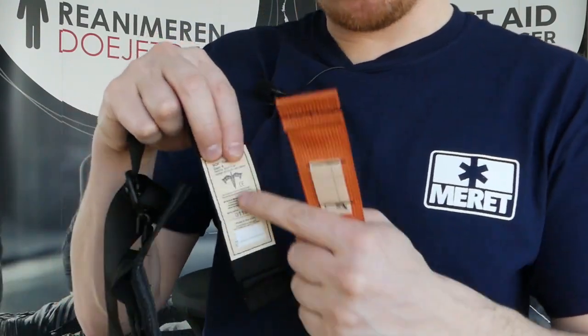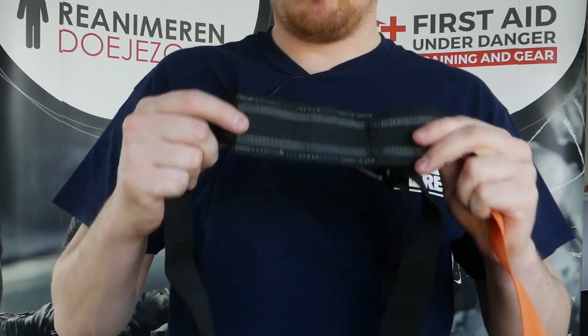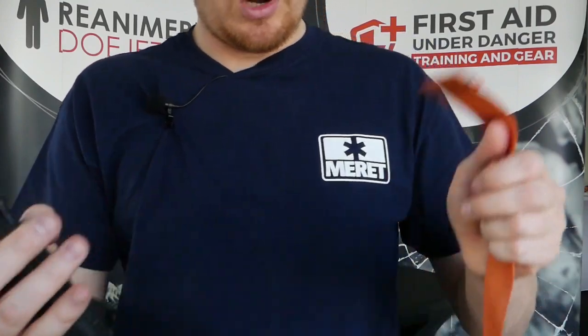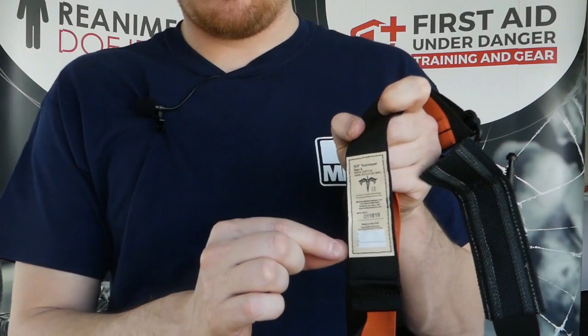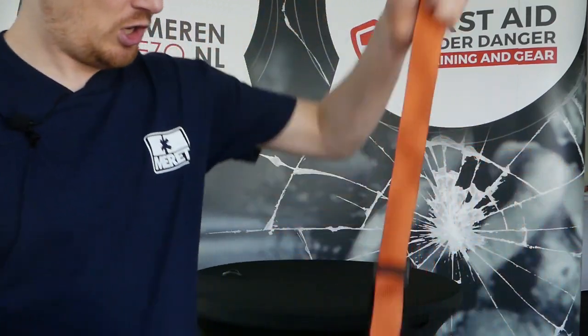I think they've changed it to the end because this is mostly the part that you can no longer see because it's on the side of the leg, so you won't be able to see the manufacturing date, you won't be able to see the lot number, and it would be strange if you want to combine, for example, the time and all the other information on this side. You won't be able to write down any more time. So I think that might be the reason why they changed it.